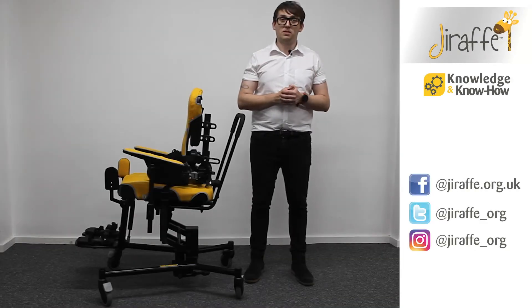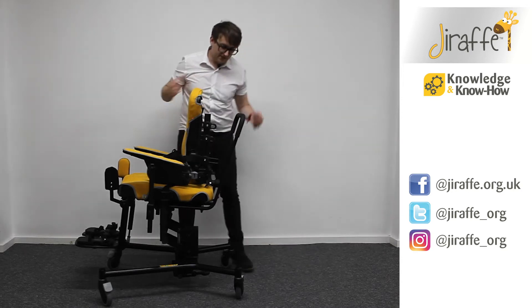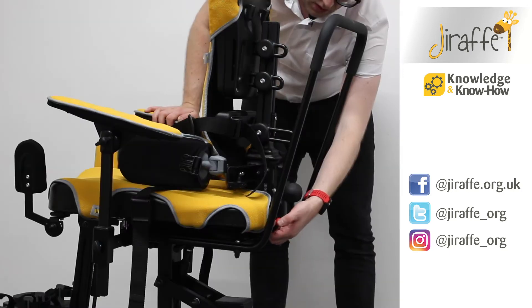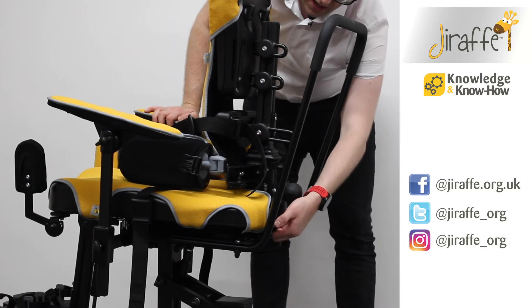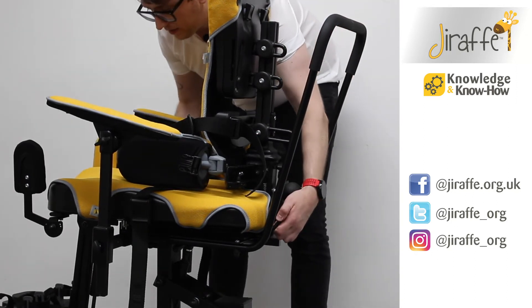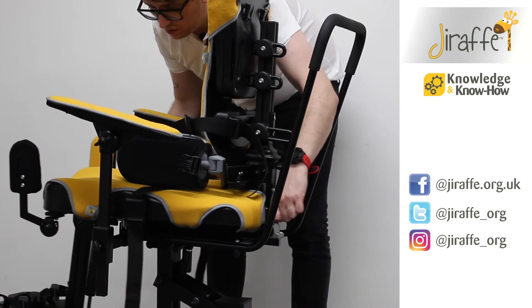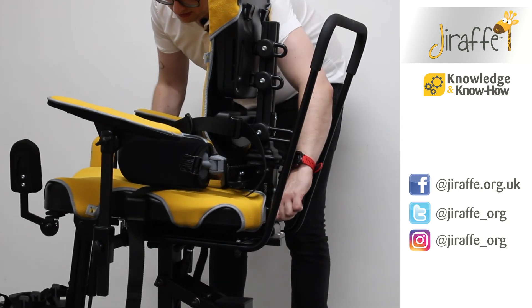If you're looking to adjust the seat depth from the multi seat, the mechanism can be found at the back of the chair. It's this black lever here with the red ball on the top. All you need to do is turn that lever in towards the chair, and then you are able to move the seat depth to whatever position you need it to be in.